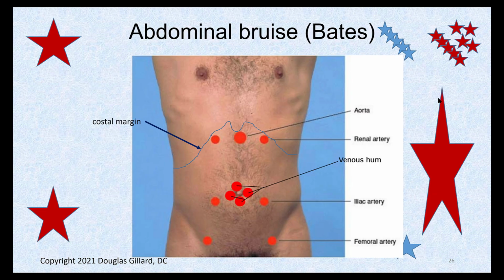You can read exactly where we're auscultating. Let's just use the diagram. So here's the xiphoid process. So to auscultate, if I say auscultate for a renal or for an abdominal aortic aneurysm, you will find the xiphoid and just go below the xiphoid, maybe just a hair to the left. Put the stethoscope right here and listen. 1001, 1002, 1003. With the bell, you're listening for whoosh, whoosh, whoosh.